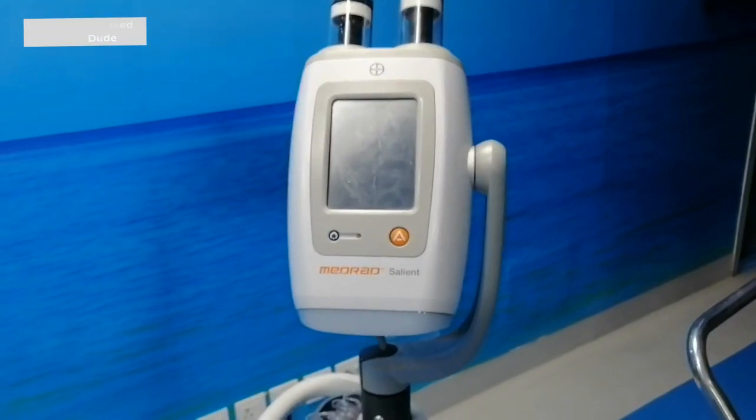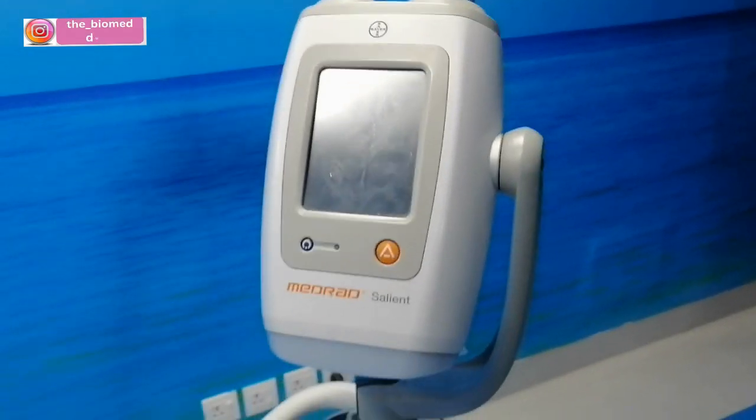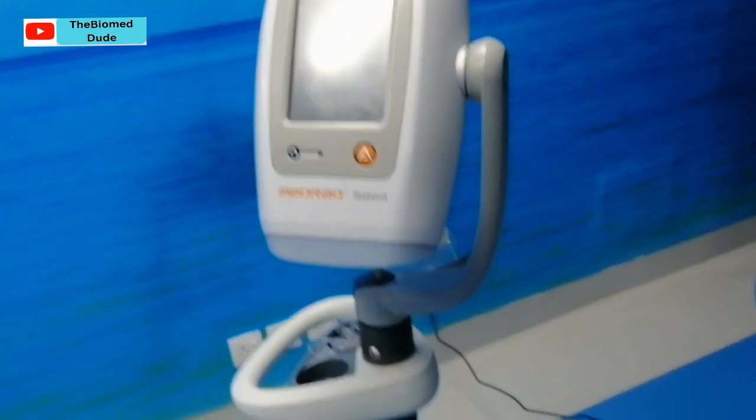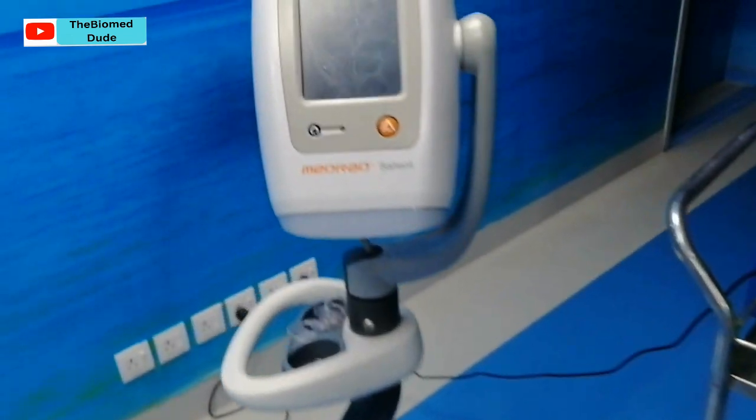Hello guys, my name is Adeel and you are watching the Biomed Dude. Today we are discussing the Medrad Salient dual head injector. This is used in CT scan and cath lab also. I am currently in the cath lab.